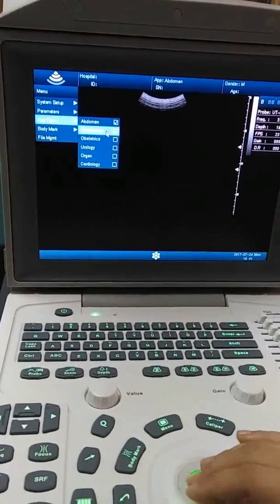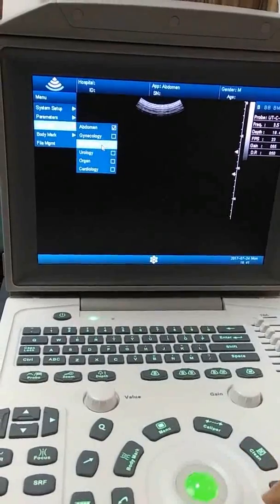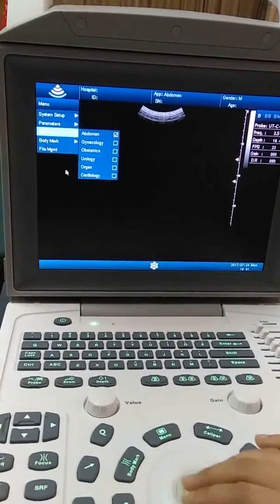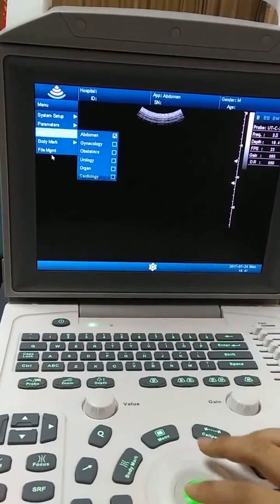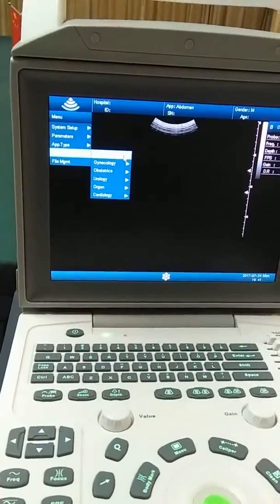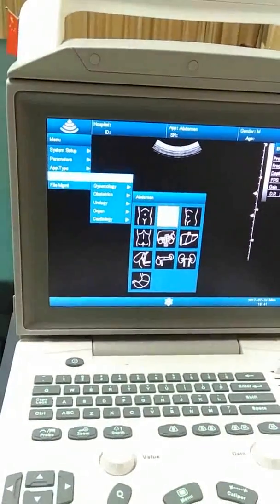The application types include: abdomen, gynecology, obstetrics, urology, organs, and cardiology. You can also set the body mark, with different body mark options available here.